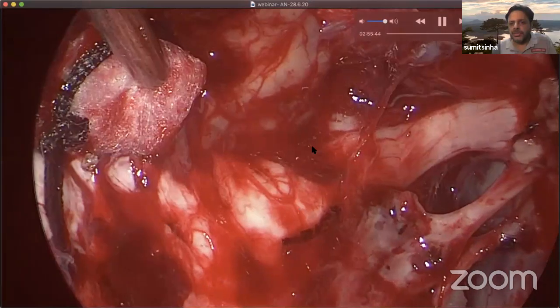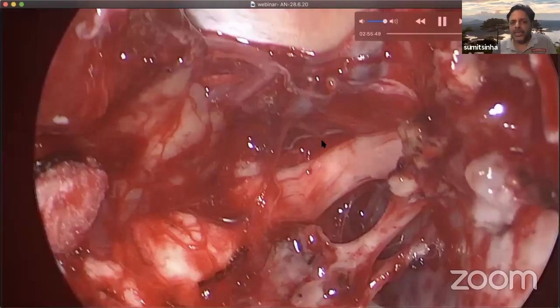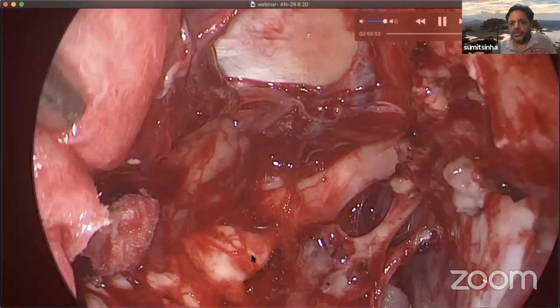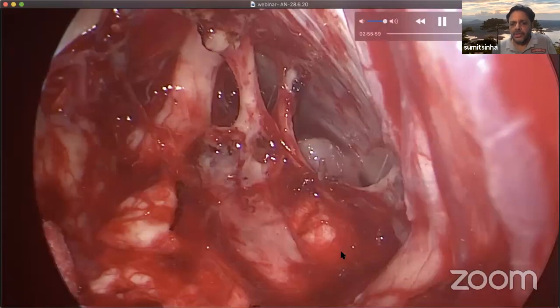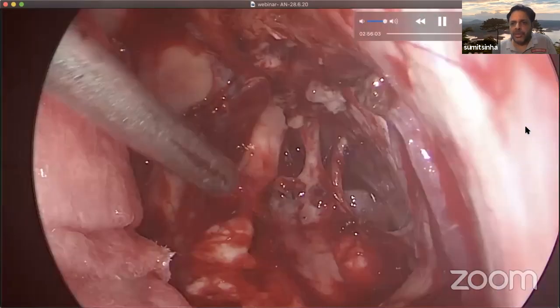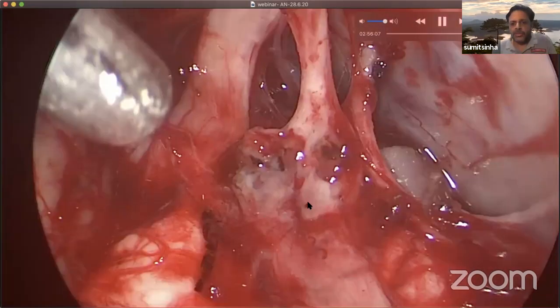So at the end of the surgery, many a time the endoscope helps in identifying and locating the residual portion of the tumor, and it can be further removed with the help of an endoscope. Now, these are the lower cranial nerves, which are very well visualized and safely preserved. This is the PICA, which you see over here among the lower cranial nerves. And this is the facial nerve.